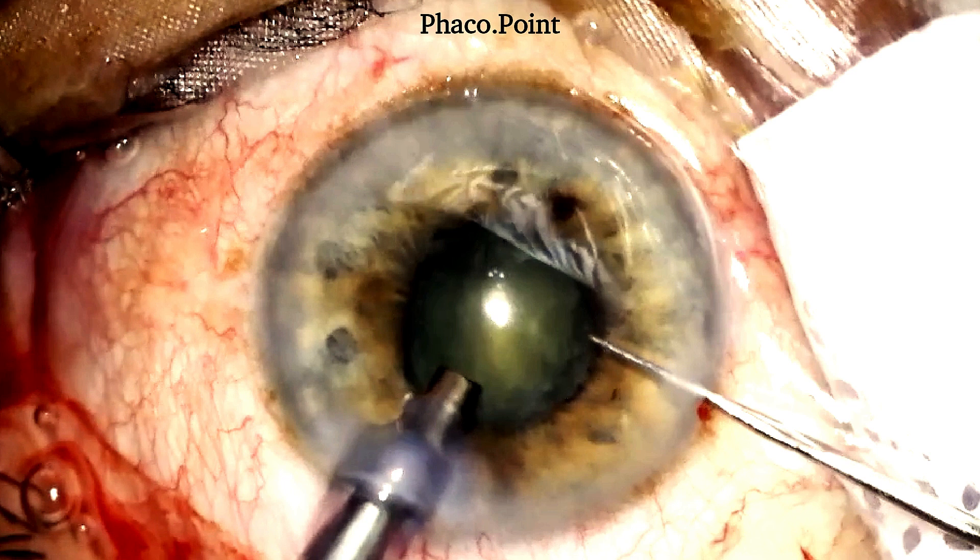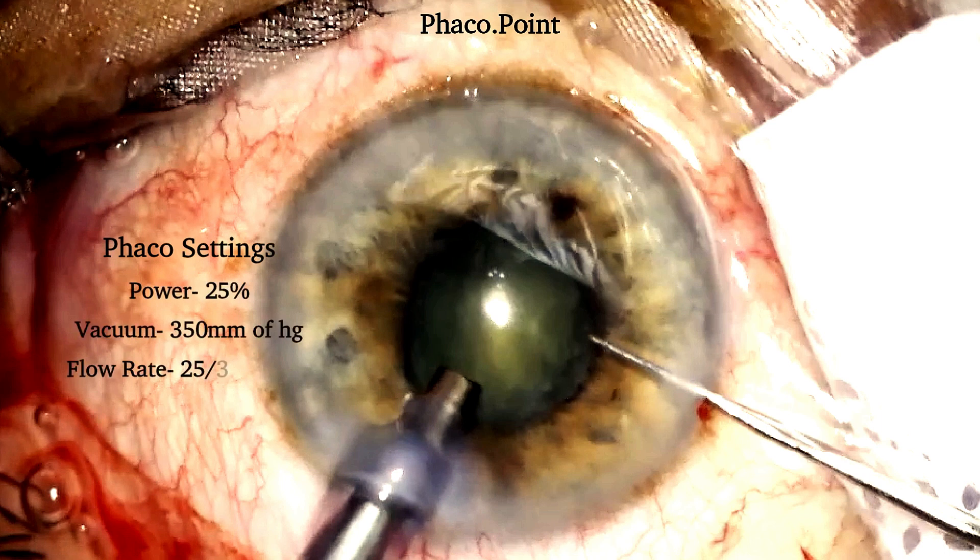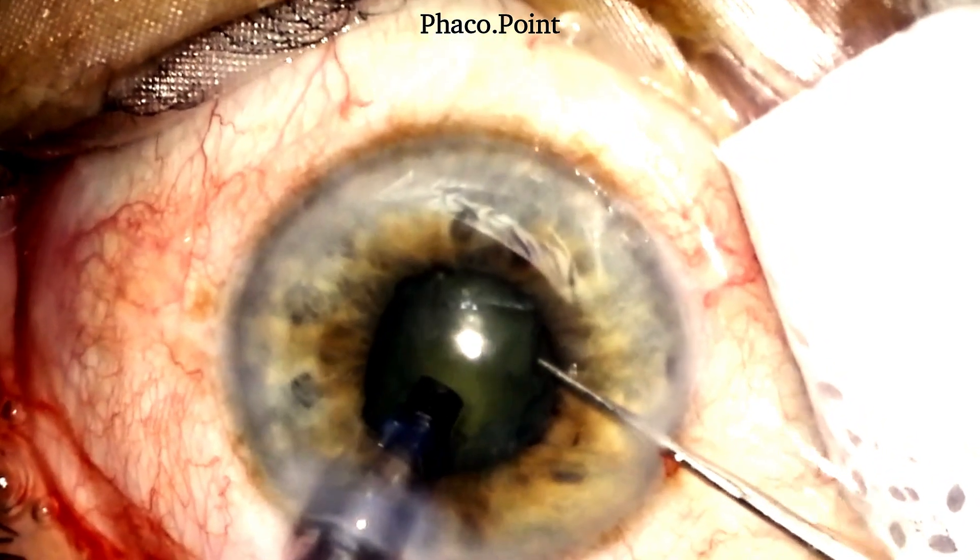The phaco settings used for performing the direct chop were as follows: a power of 25% was adequate because this is not a very hard cataract; a vacuum of 350–400 mmHg, which is required to perform the direct chop; and a flow rate of 27–30 cc per minute — kept not too high because you are working in a slightly compromised condition with a small pupil and want things to happen in a slow, controlled fashion.